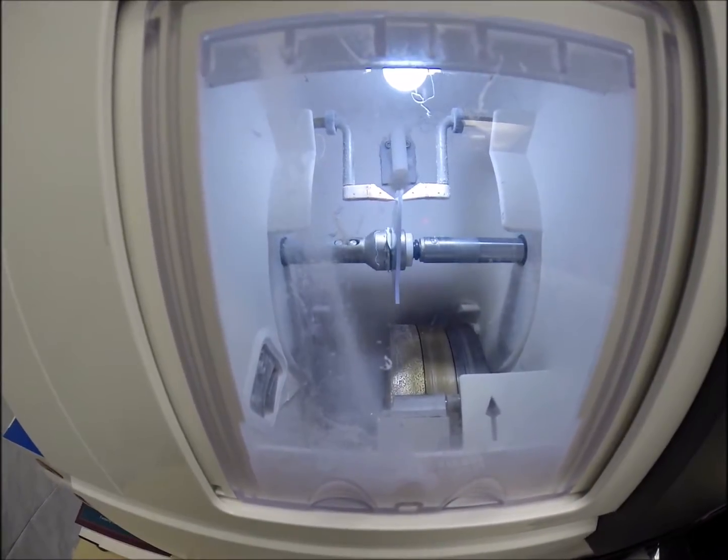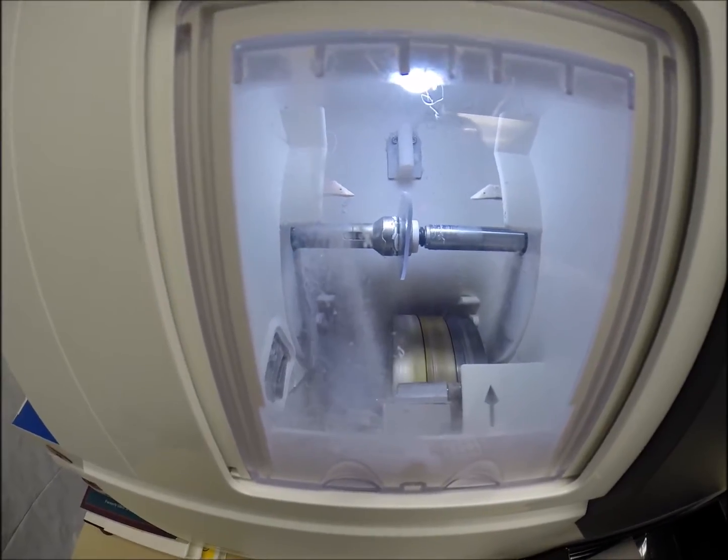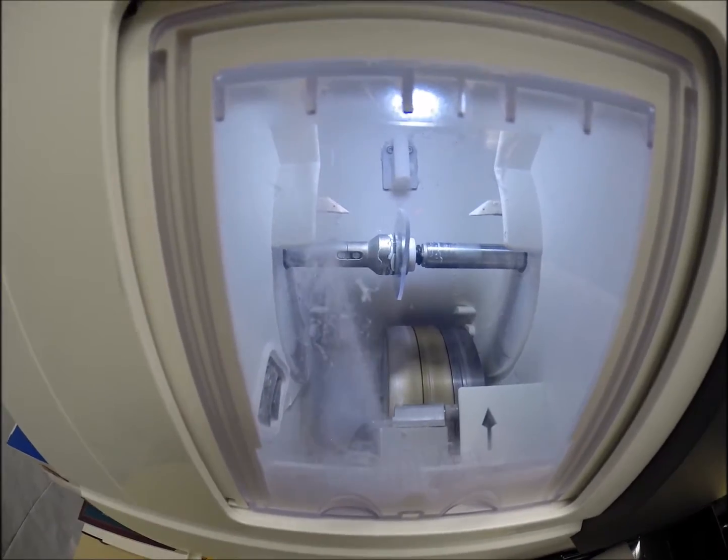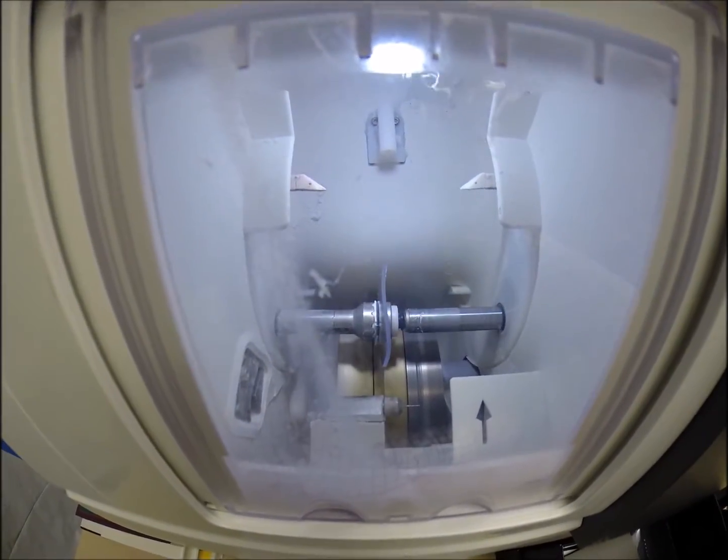Now, if you notice your lens is completely flat like a nickel, if I were to take it out, it would stand up on the counter on its edge. It's now going to drop down onto the bevel wheel and get the V-shaped bevel.